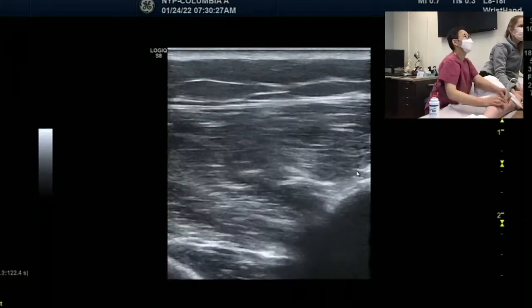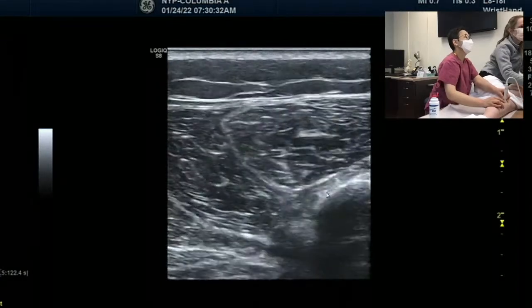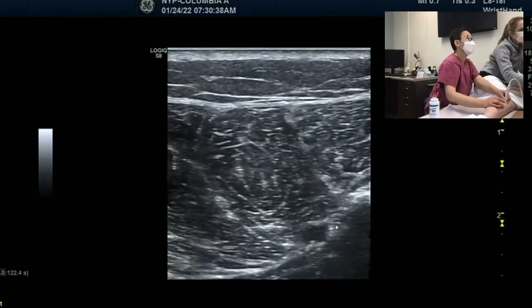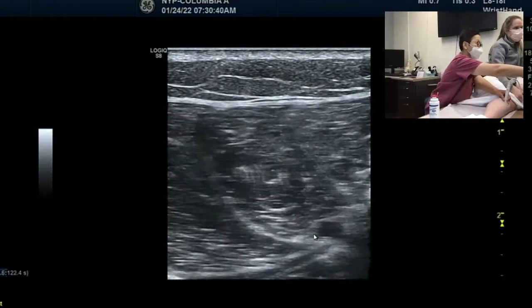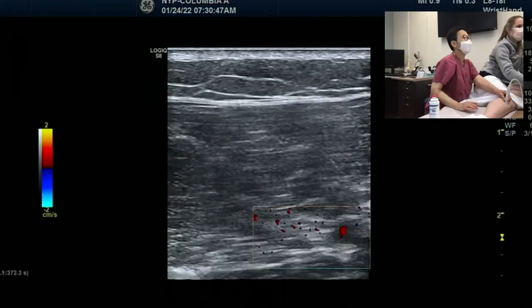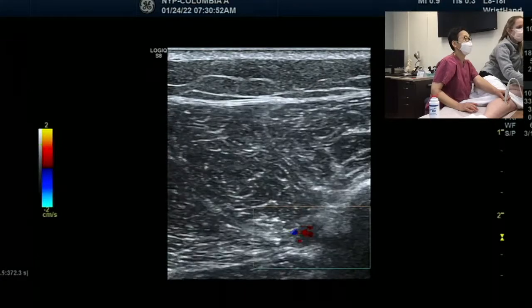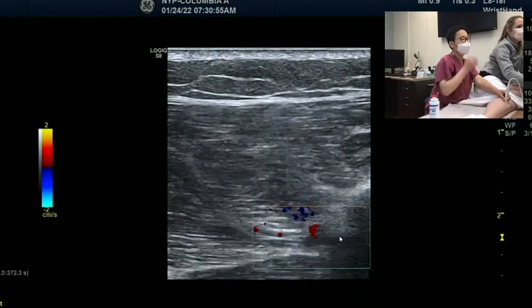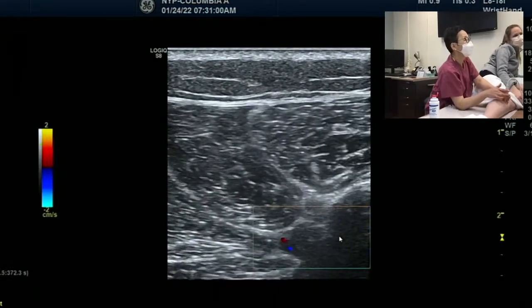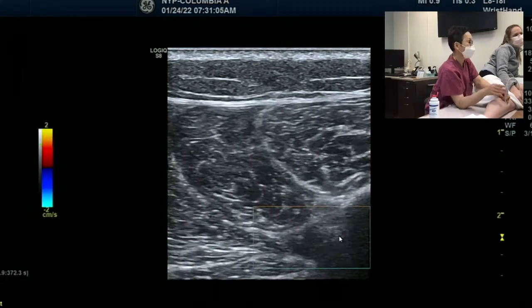Now it's moving, I see it, coming down into the interosseous membrane area. Now we are there, finding the anterior tibial artery. Let's put the color on it. Okay, put it over there in the corner. That's the anterior tibial artery, and the nerve is right next to it. Right here. This artery is not just next to the fibula. As you scan down, the anterior tibial artery moves into the medial side. So we're going to make it deeper.